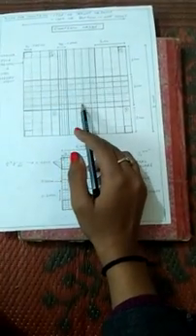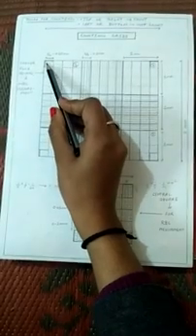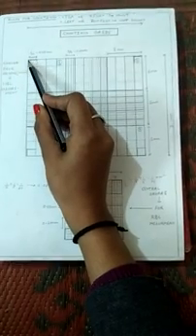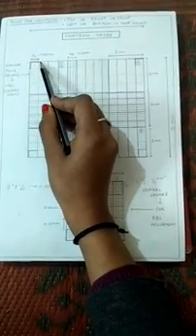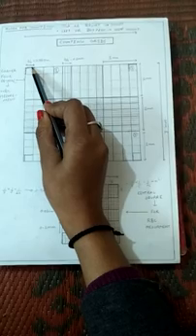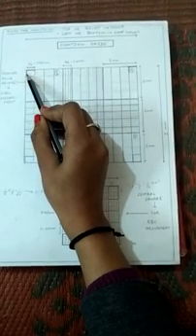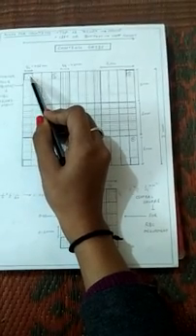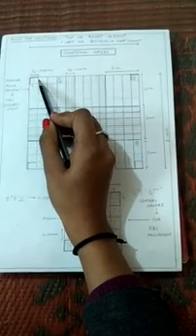So friends, this whole middle big square is used to measure RBCs, and these four corner squares are used to measure WBCs. And what rule is followed to measure them? So friends, here you can see these dark lines. So we count the number of WBCs only at the top and at the right side. At the bottom or at the left, if a WBC is present, then we do not count it. We only count the WBCs which are present at the top, at the right side and in the middle. At the left and bottom side, the WBCs present are not counted. This is the rule for counting WBCs, and the same rule is followed for the RBCs.